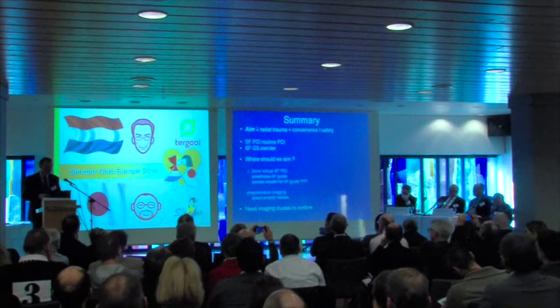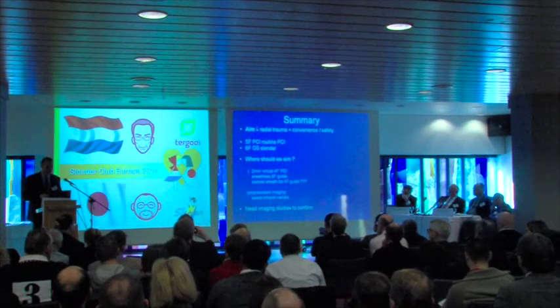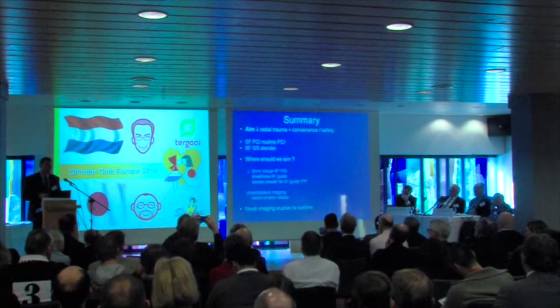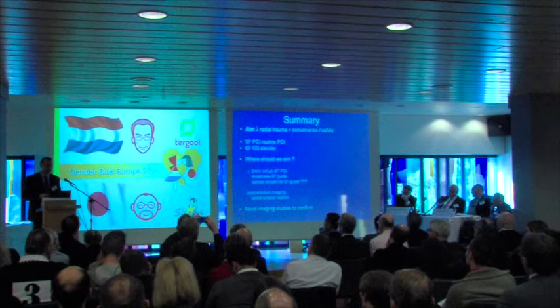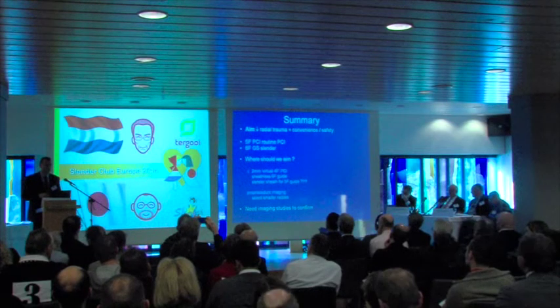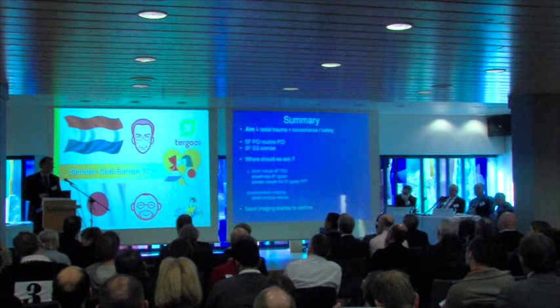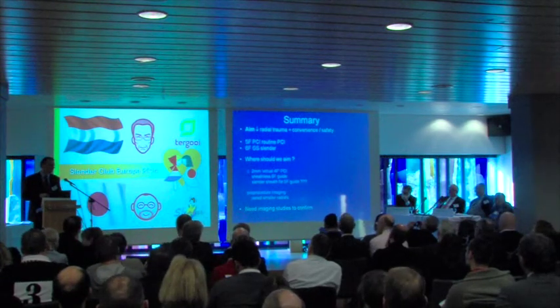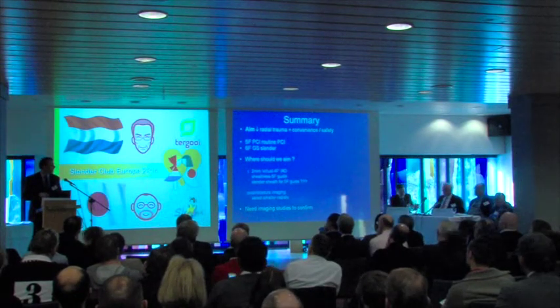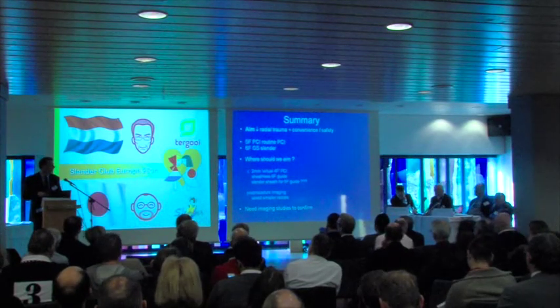It is important to reduce radial trauma, but maintain convenience and safety of the procedure in terms of the coronary outcomes. I think that the Glidesheath Slender is really a very significant advance to doing 6 French angioplasty. 5 French has been used for more simple angioplasty for many years, but still has the issue of no good solution for thrombectomy, and in Europe no good solution to kissing balloon. And I think that there is definitely a rationale for working to smaller systems.